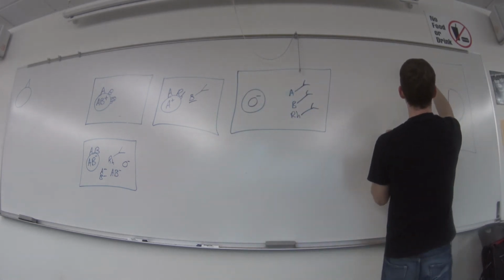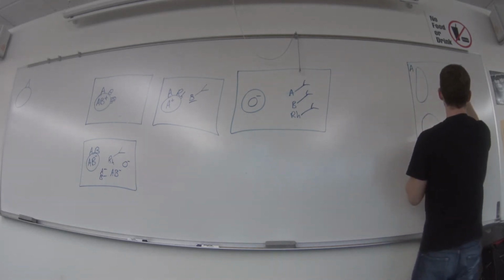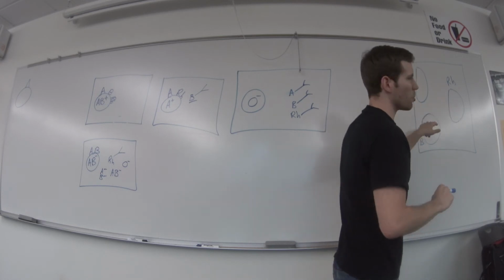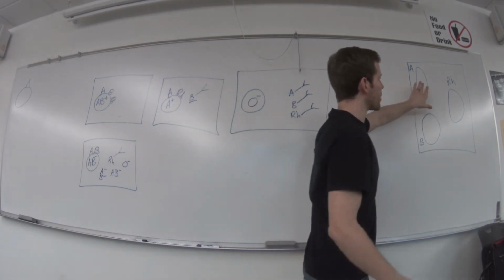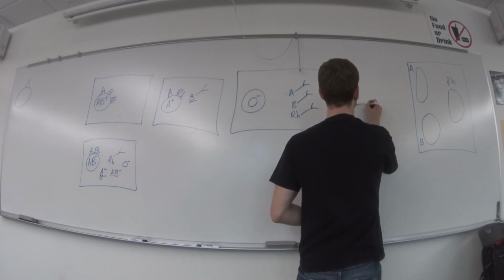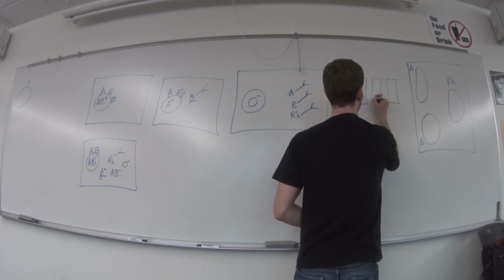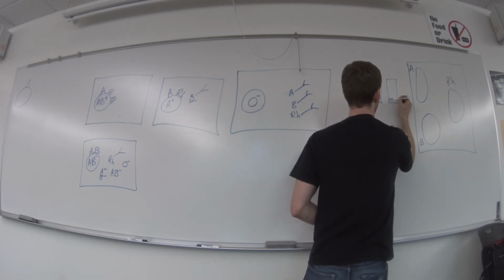So it's labeled as A right here, B down here, and RH up here. So your blood, you're going to have hopefully a good sized drop of blood inside of each one of these. The more blood, the easier it is, but you really can do this with a small amount. It's just a little harder. You're going to have 3 identical drops of blood, and then we have 3 different antibodies that are in the freezer right now because they have to be kept cold. We have 3 different ones. 2 of them are different colors. One of them is anti-A, the other one's antibody B, and the other one's antibody RH.